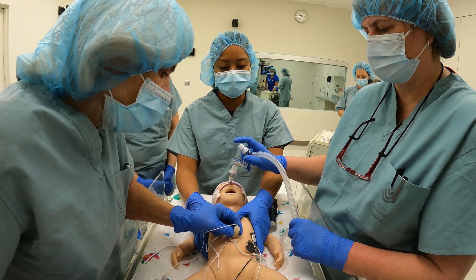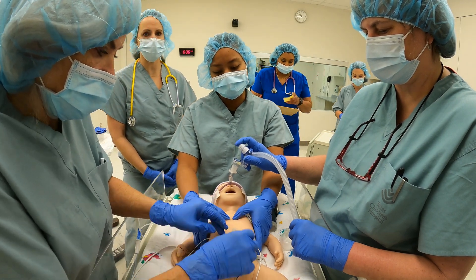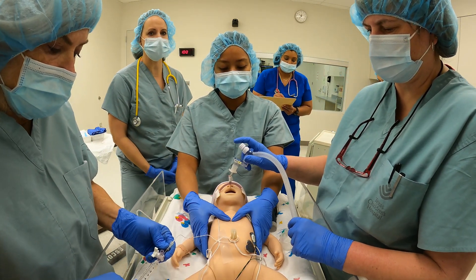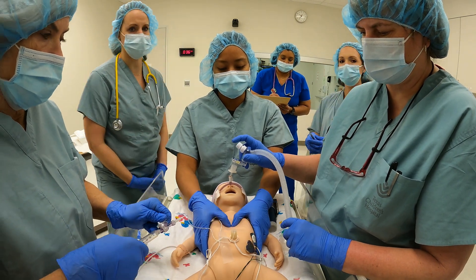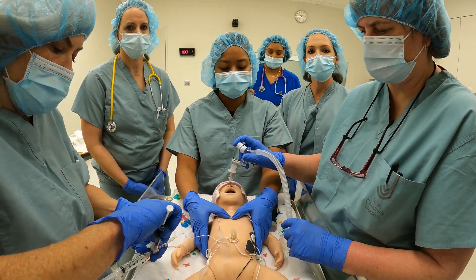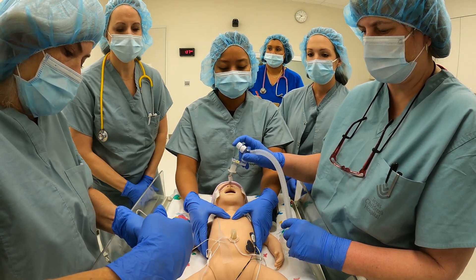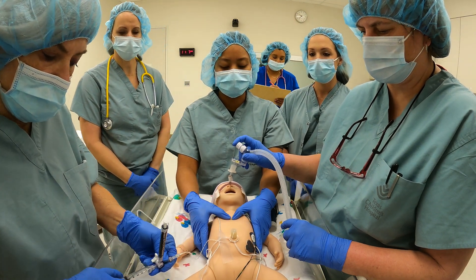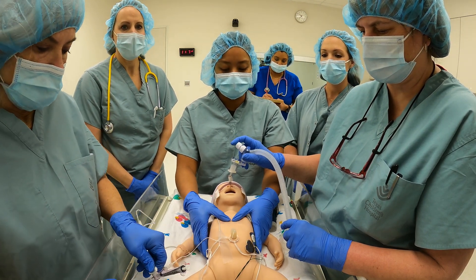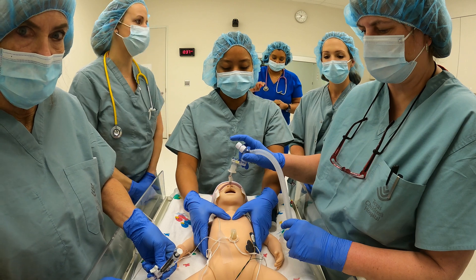I have the UVC in with free flow of blood. I'm going to secure it. Corey, can you go ahead and give our recommended NRP starting IV dose of 0.2 mLs per kilo of epinephrine? We're estimating that this baby weighs 3 kg, so that will be 0.6 mLs. I have the 0.6 mL dose pulled up in a 1 cc syringe, which is the recommended starting dose of 0.2 mLs per kilo. Don't forget to follow the epinephrine with 3 mLs of flush volume. 0.6 mLs epi followed by a 3 cc flush of saline completed. We will check the heart rate at one minute, which will be at about 9 minutes and 30 seconds on the timer to assess the response to epinephrine.